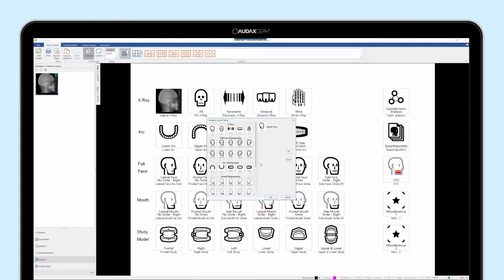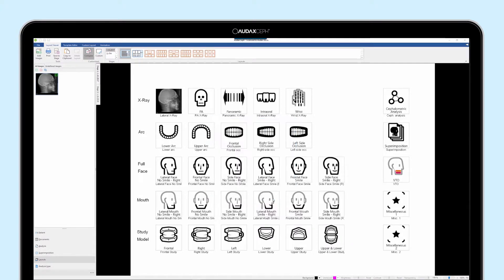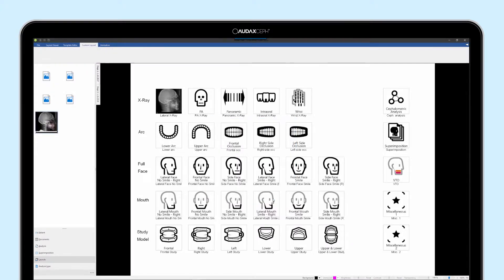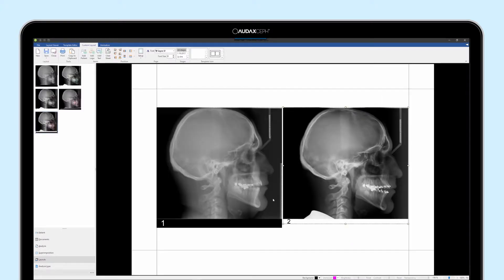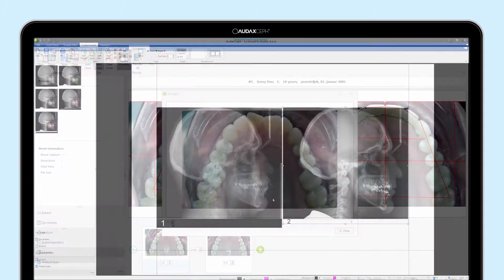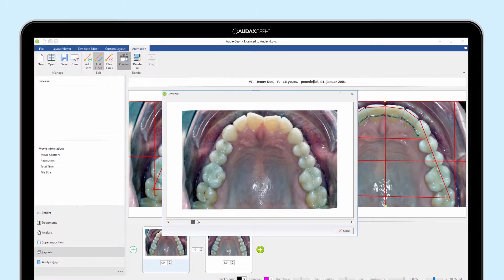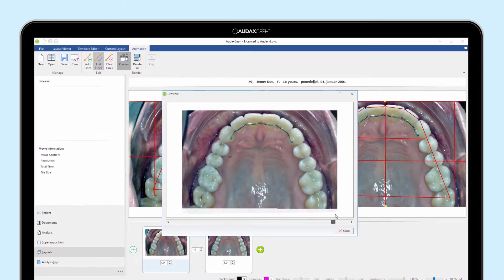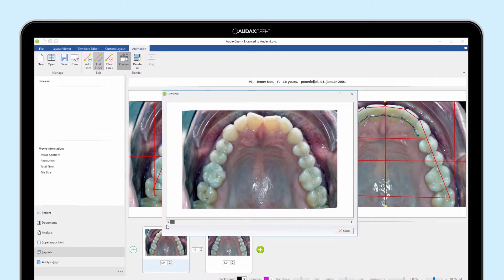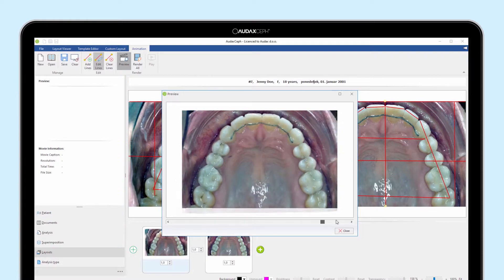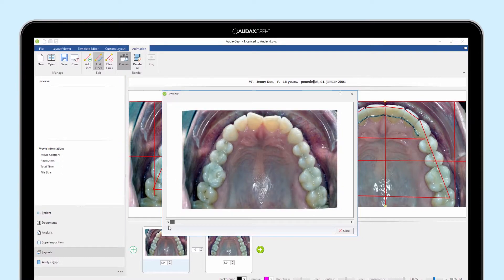What is more attractive than comparing photographs from different stages of the treatment, and at the end, showing the treatment progress from the initial to the final stage in a personalized video? Use AuduxCef Video Maker to do this.